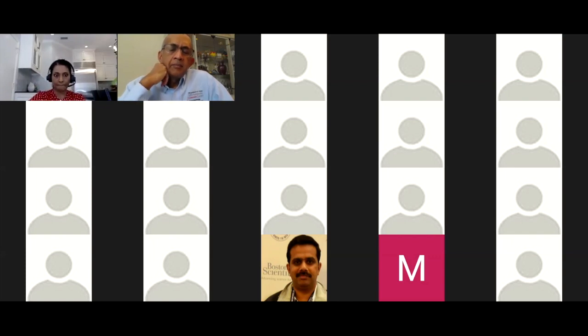I think the one difference that many units may have is that the pre-cleaning in some units is done in the room. Do you want to comment on that, Raju? You're recommending that the pre-cleaning is done in the reprocessing room, in the dirty room. Am I correct? No. We do pre-cleaning in the room itself, and I put it as operating room pre-cleaning. You should do pre-cleaning immediately as you suggest, right? And that's what we do. The moment the scope comes out, while we are in the room, while the patient is being turned from, like, an EGD to colon, we do the pre-cleaning.